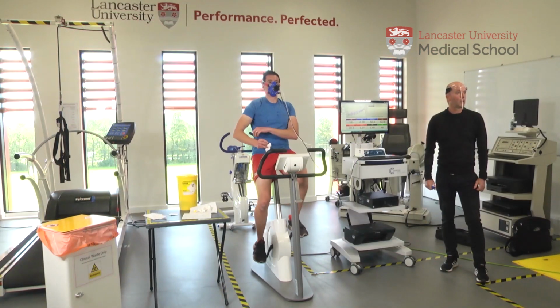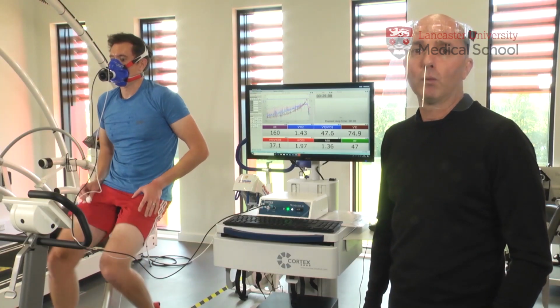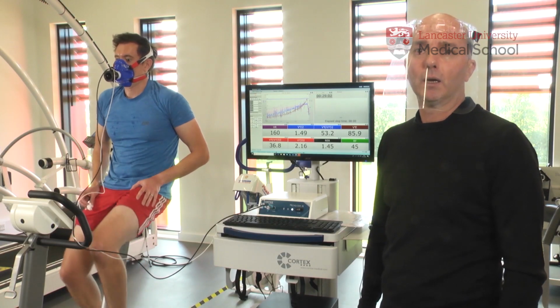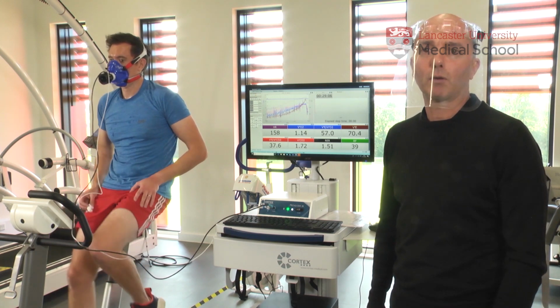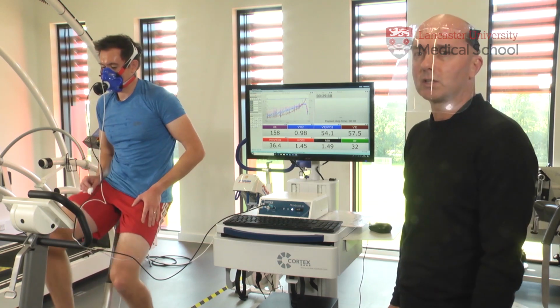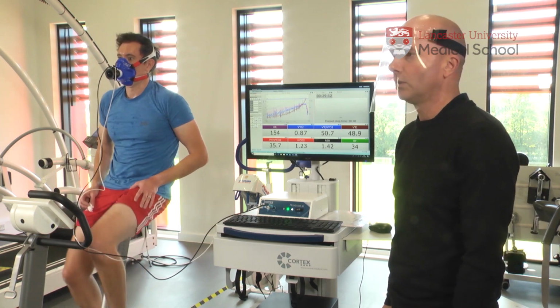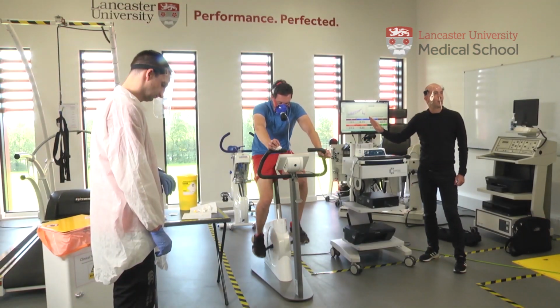Once the final reading for lactate is collected, we will plot the data on the whiteboard and do a simple lactate threshold graph. And make sure that Chris is warming down after his exertions. Okay, it's good that Chris is now in recovery.